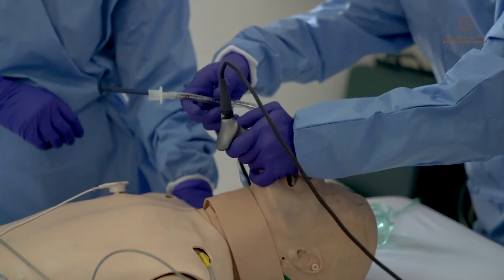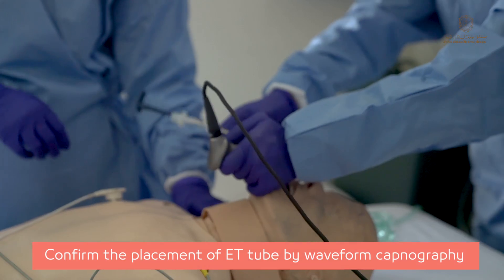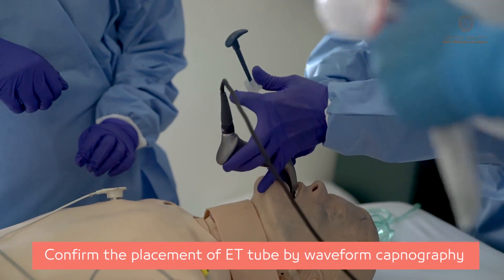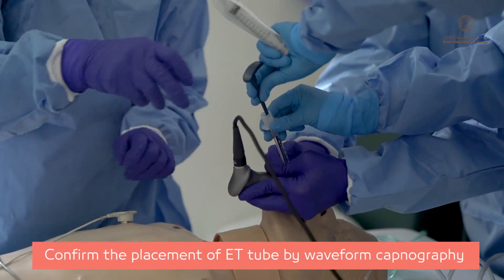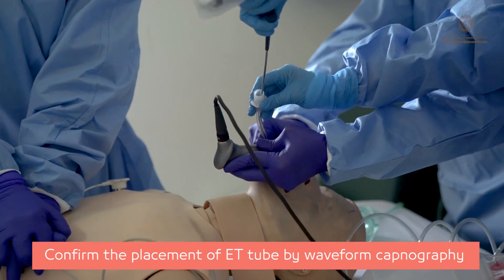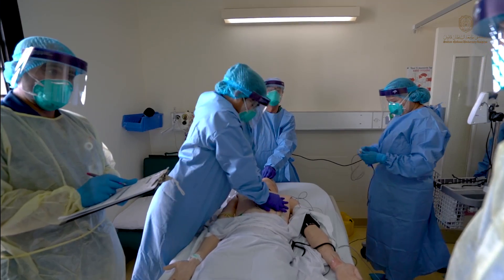There are a few advantages of using a video laryngoscope in these patients. One: it decreases the proximity between the operator and the patient. Two: it decreases the duration of the procedure. Three: it decreases the number of attempts to intubate these patients.